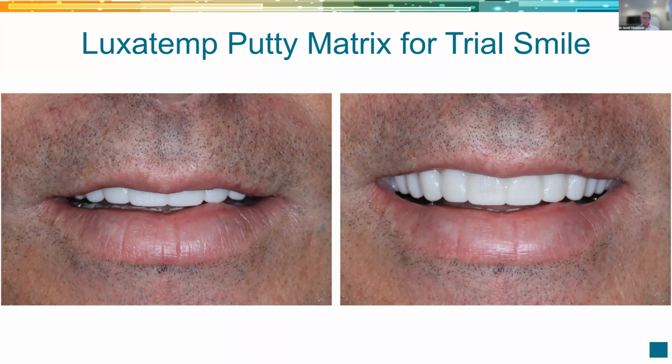Patient's not numb. And so once again, we've got our photos, we've got our CAD design, we've got our in-the-face emotional mock-up, if you want to call it that. This is a real trial smile, and it's looking like everything that we've been planning so far, all because of just having the predictability of what we've done up to this point.